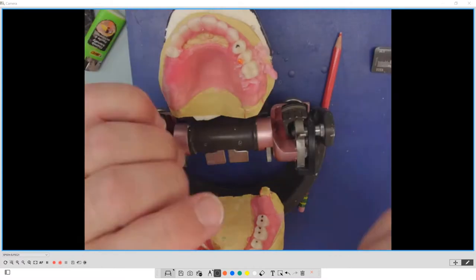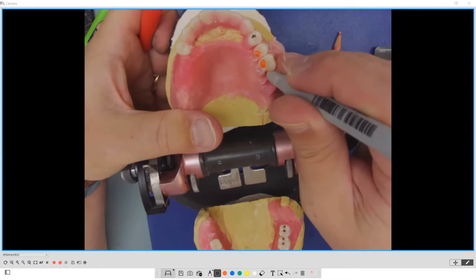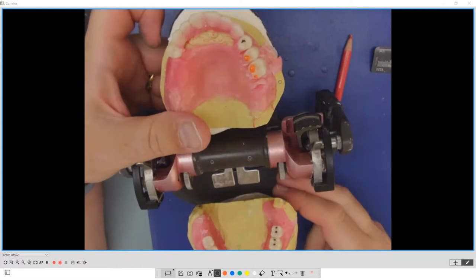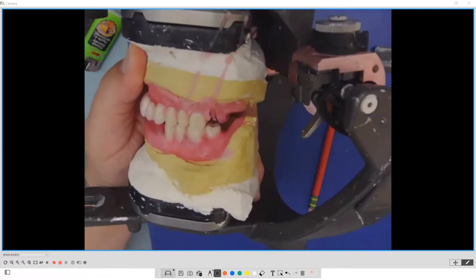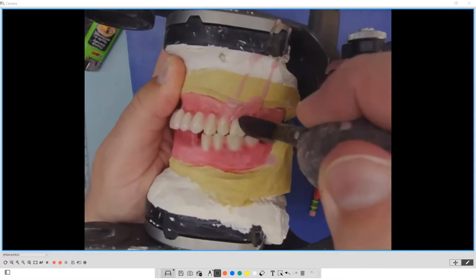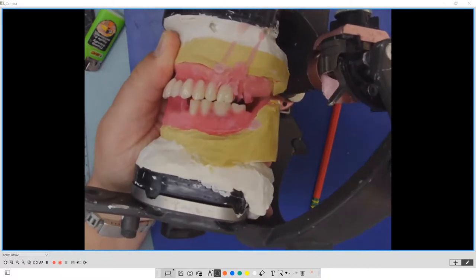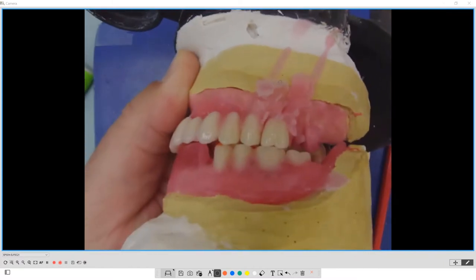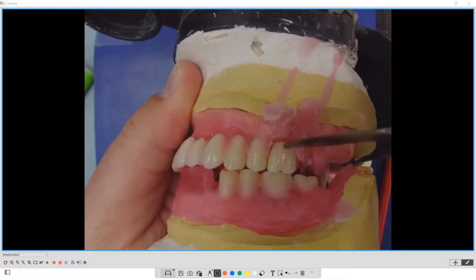So what I'm doing now is I'm taking this and the secondary. So those cusps in red. Okay. And then I'm going to position it so that it comes into contact on the bottom. Okay. Now what you notice on these teeth, so just like this. Okay. Now I have the ability to take this. Now let me just go a little closer. Okay. I have the ability to take that tooth and I can push the neck in.